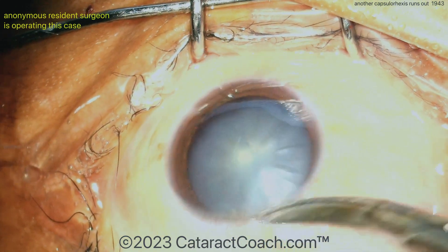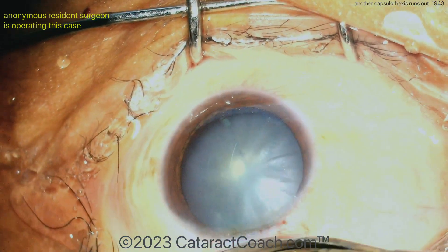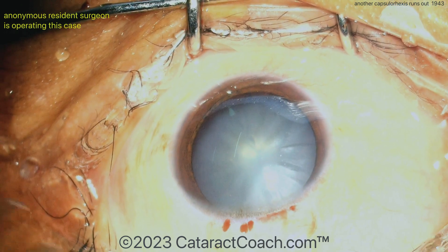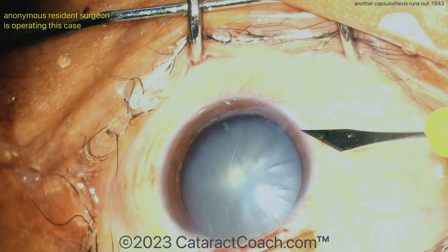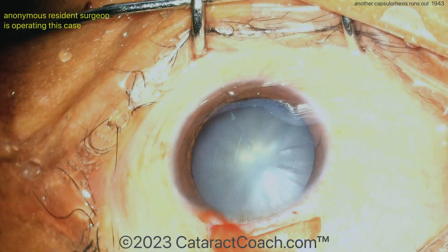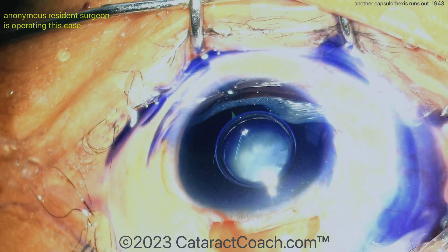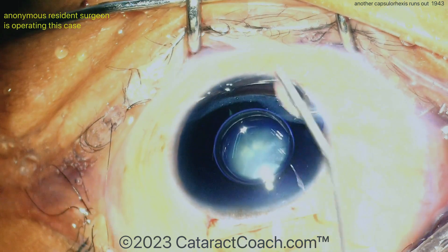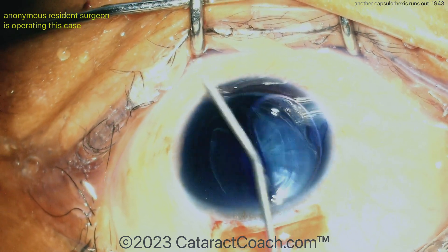No phaco probe needed here. Surgeon sitting superiorly, creating a superior peritomy with the Westcott scissors. Now let's see the incision — there's the incision. Here's a paracentesis to enter the AC; that's a pretty wide one, maybe going to be using a Simcoe cannula through that. Trypan blue dye going in — push the dye around. Reasonable approach.